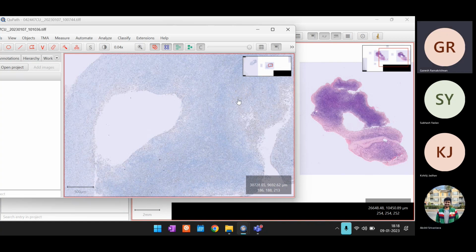Facility location to identify the different possible microenvironments. Okay, different segments. We want the targeted subset because the microenvironments must be around the Reed-Sternberg cells we get through the consensus model, right?